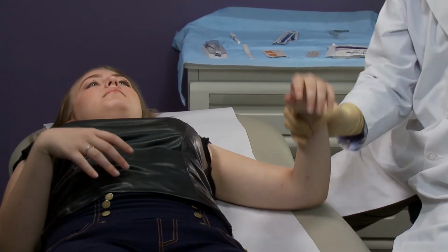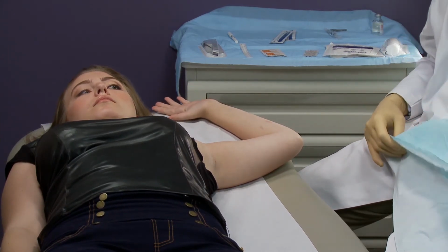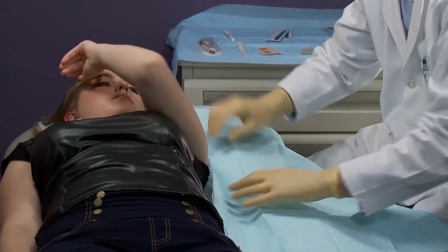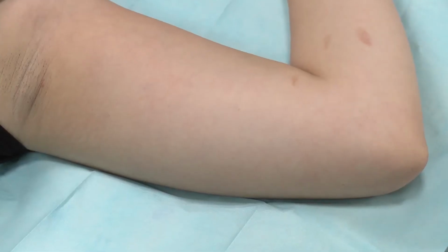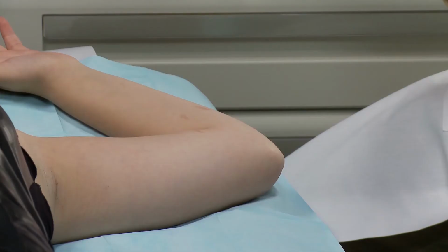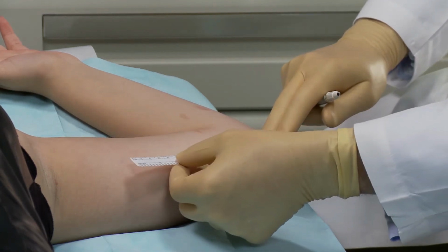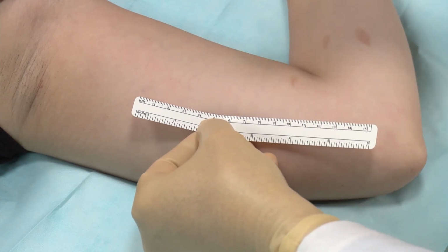Have the woman lie on her back with her non-dominant arm flexed at the elbow and externally rotated. Her wrist should be parallel to her ear, or her hand is positioned next to her head. Identify the insertion site, which is at the inner side of the non-dominant upper arm, about 8 to 10 centimeters above the medial epicondyle of the humerus, avoiding the sulcus or groove between the biceps and triceps muscles and the large blood vessels and nerves that lie there in the neurovascular bundle deeper in the subcutaneous tissue. The implant should be inserted subdermally, just under the skin.